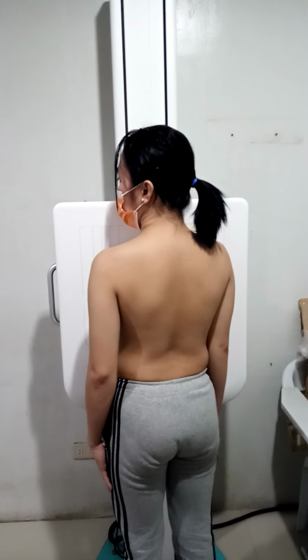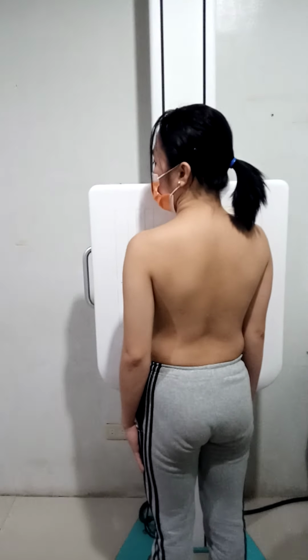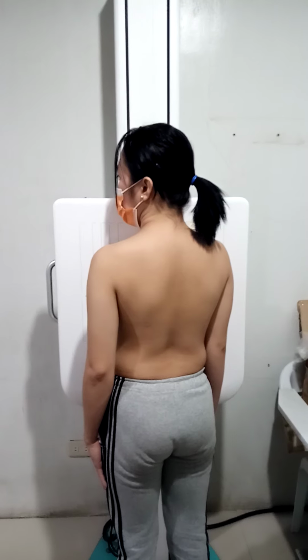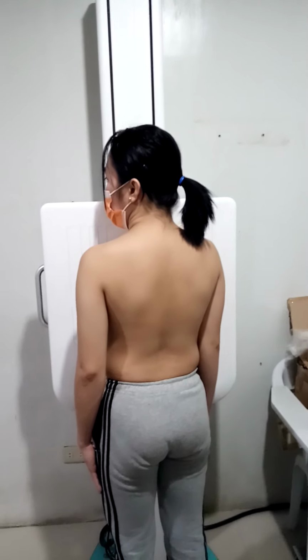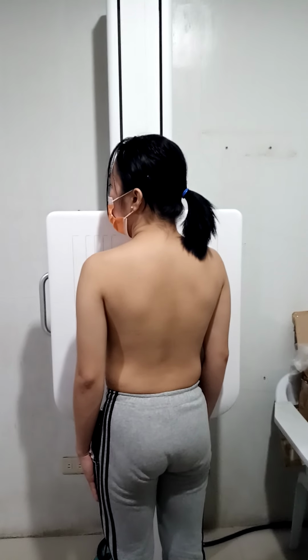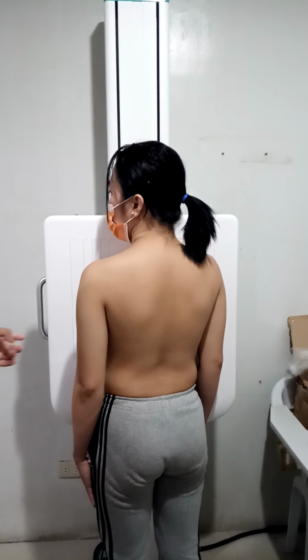In exposure, a 3 to 4 second exposure using breathing technique, so lung markings appear blurred, with optimal contrast and density to visualize the entire sternum. Then bony margins should be sharp. The next position is the right lateral position of the sternum.